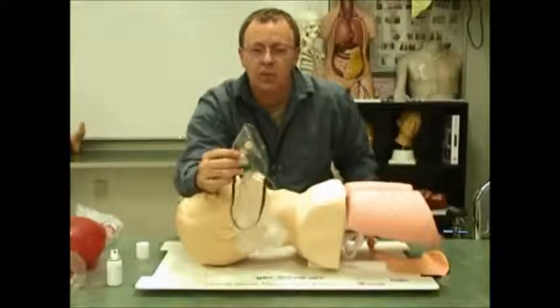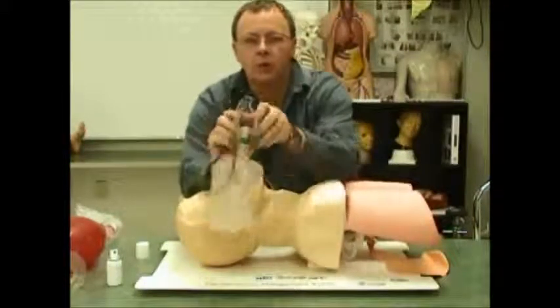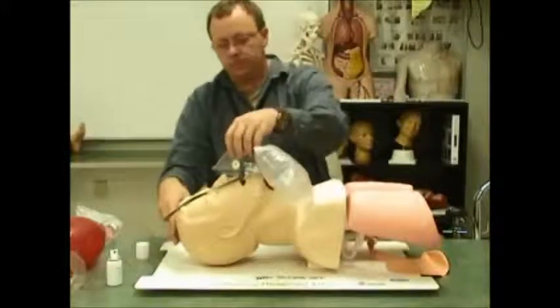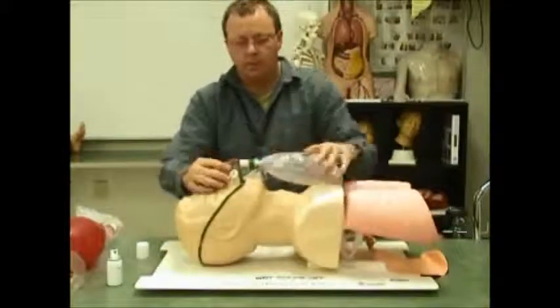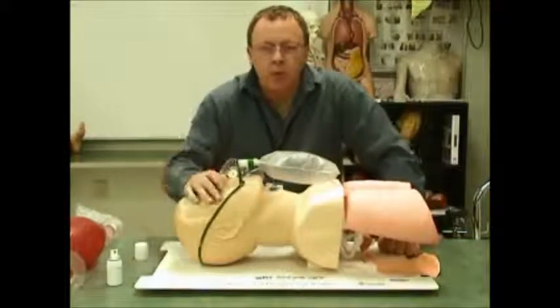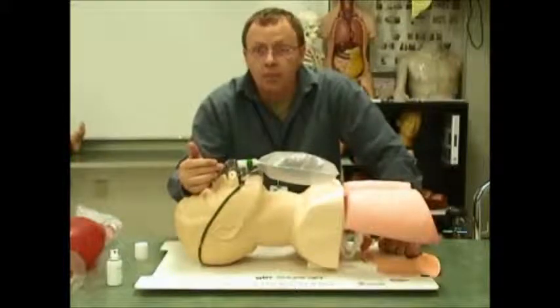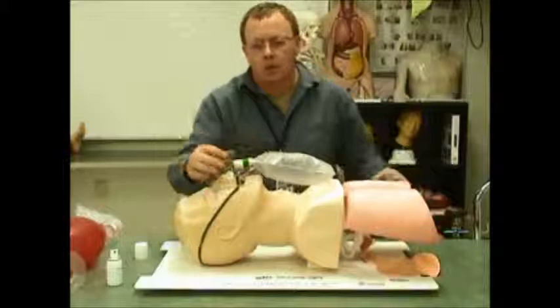I will now allow oxygen to go into the mask. At 15 liters, we take our finger and place it over the small valve, which will allow the reservoir bag to fill up. At this time, we can now apply the non-rebreather mask. All O2 delivery devices must be running before we place it on our patient. Be cautious with a non-rebreather mask — make sure that the reservoir bag is always filled and oxygen is being delivered to the device. If the oxygen were to run out or if the O2 tubing was disconnected, our patient may suffocate as a result.